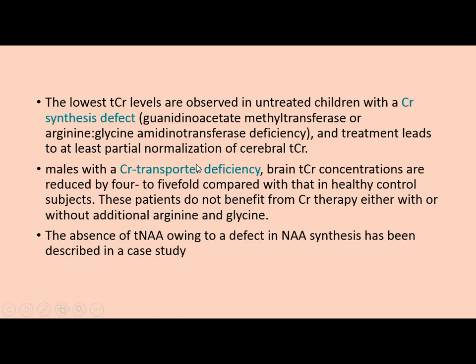So by spectroscopy, you can differentiate even these types. But in all 3 types, the creatine is low. To differentiate between type 1, 2, and 3, after treatment you can do another spectrum. So they give treatment and they do another imaging. If the creatine becomes normal, then it is a synthesis deficiency. If it does not become normal, it's transporter deficiency. And if we have liver disease, it's regarded as transport deficiency? I don't know. I really don't know.